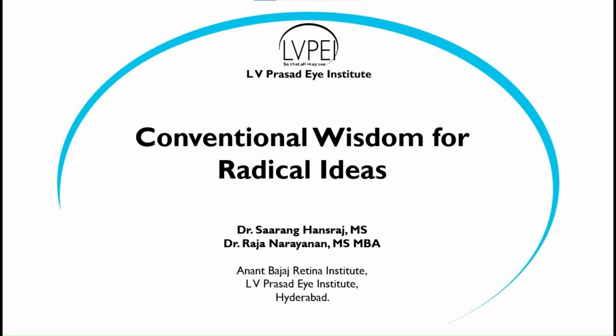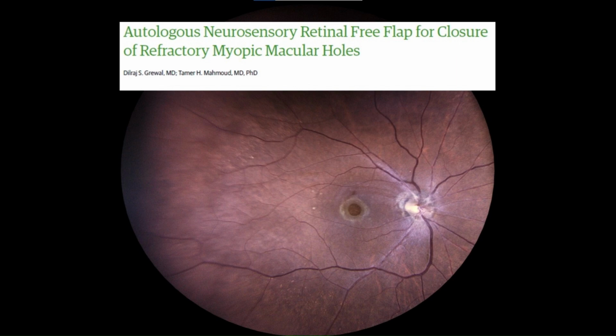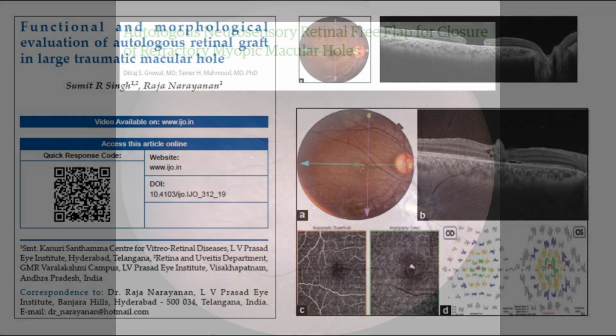Hello everyone. I shall be describing our video titled Conventional Wisdom for Radical Ideas, where I shall describe our experience with a repeat retinal autologous transplant after the primary graft dislocated upon using fibrin glue.